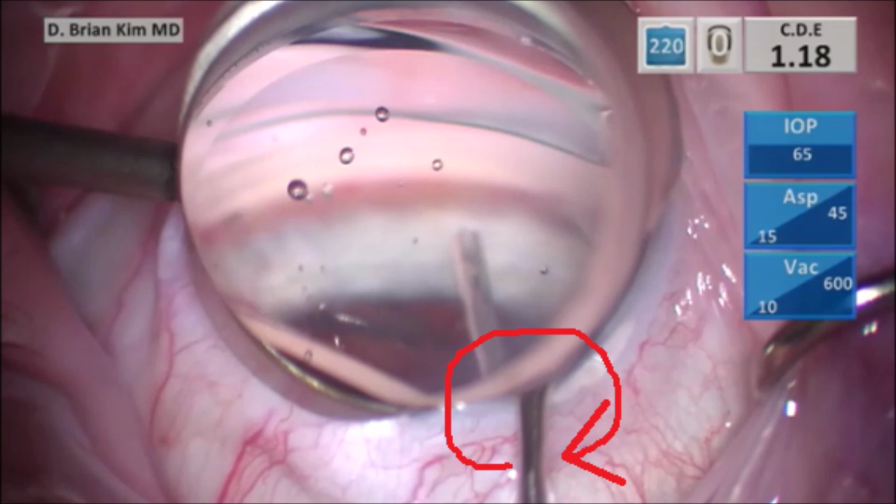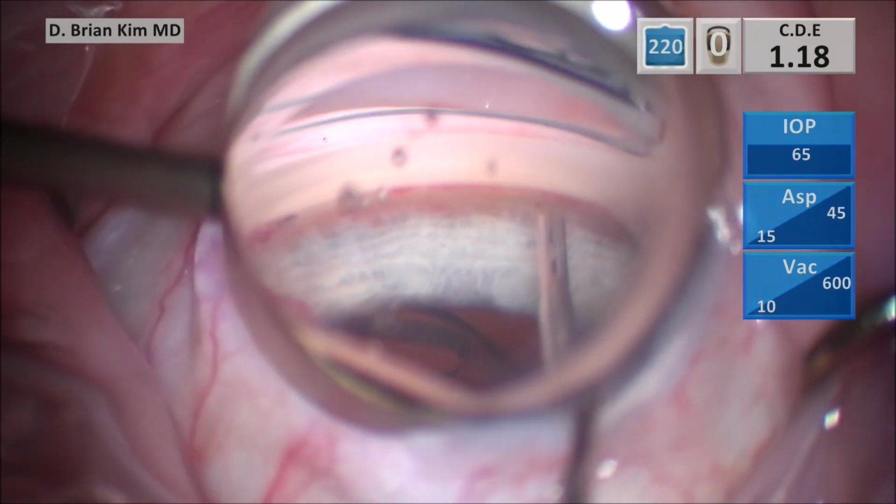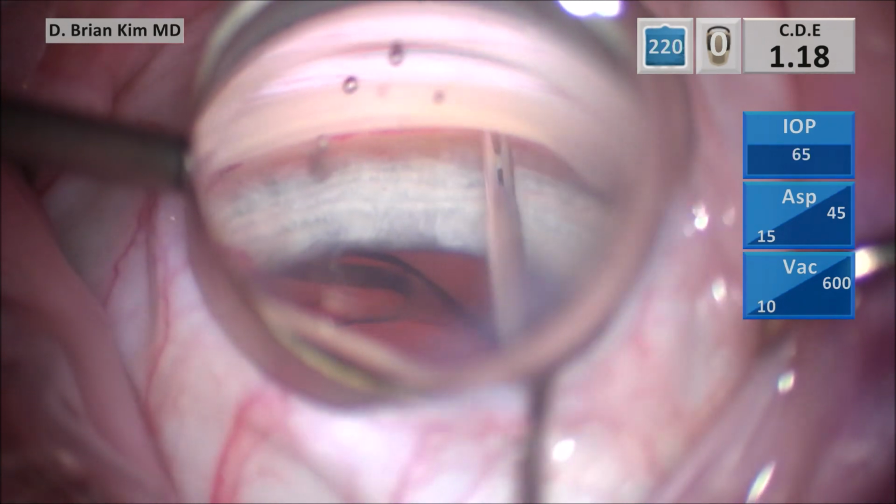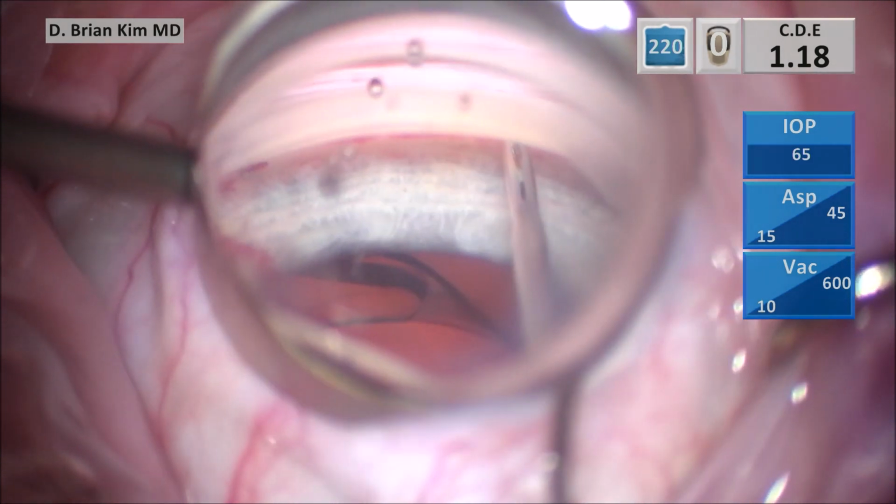And so if you rotate it slightly clockwise, you'll be able to get that tip more towards the right side of the angle, away from the first stent, without encountering and putting pressure on the incision. By not putting pressure on the incision, you won't have corneal stria. You won't be causing the whole eye to move as you're trying to get the device into position. By rotating it within the incision and not touching the incision, you'll be able to position the device in a more perpendicular approach to the trabecular meshwork. Once you're able to do that, you do the dimple down technique, fire the device, and it goes in nicely.